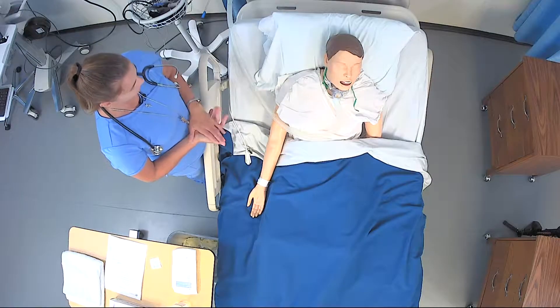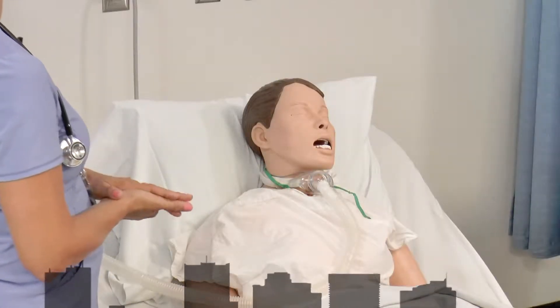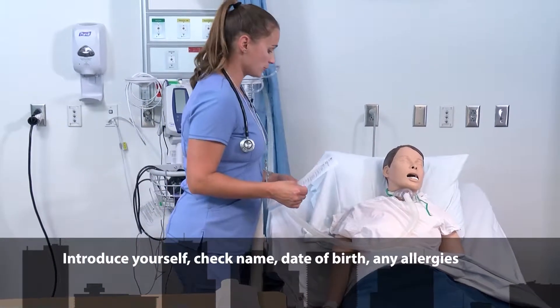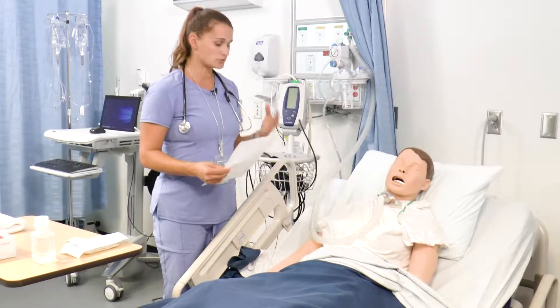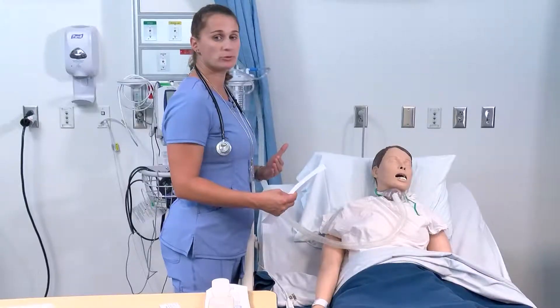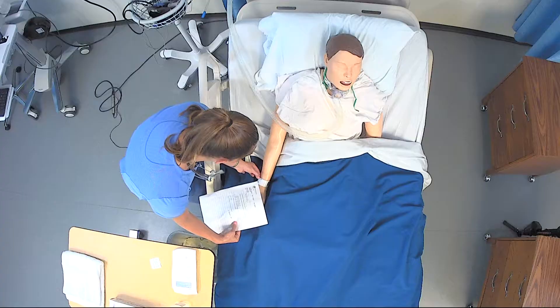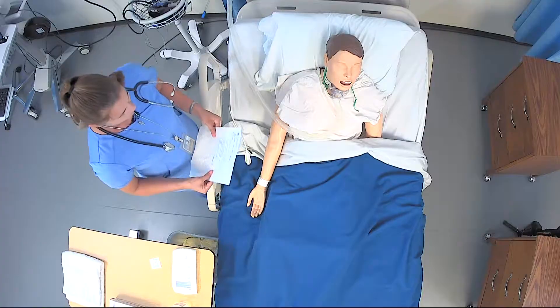Hi, I'm April. I'm going to be your nurse. I'm going to be performing tracheostomy suction on you, but first I need to confirm your name, date of birth, and any allergies you might have. I'm going to check those things against the MAR, the patient will verbalize their name, date of birth, and allergies, and I'm checking the band on their wrist to make sure everything matches.